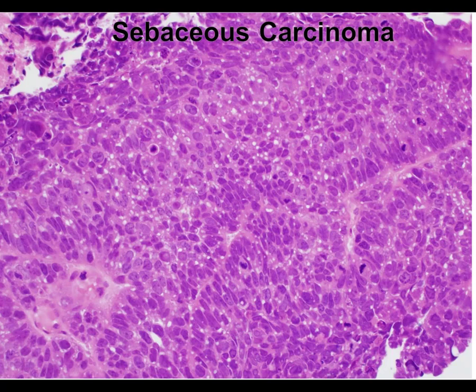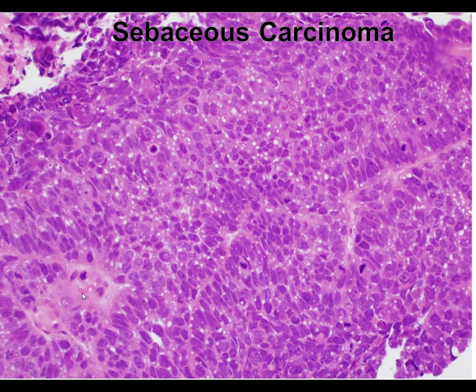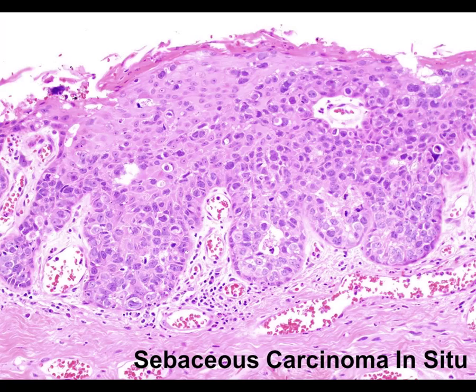Here we have another example — look at the angulated nuclei. Dr. Kazakov always taught me that whenever you see a poorly differentiated tumor around the eye with angulated nuclei, that should prompt you to think about sebaceous carcinoma. Remember, sebaceous carcinoma can involve the overlying epithelium or epidermis. With a shave biopsy around the eye this can be confused with squamous cell carcinoma in situ — things to look for are the presence of vacuolated cytoplasm and the lack of complete full-thickness atypia.